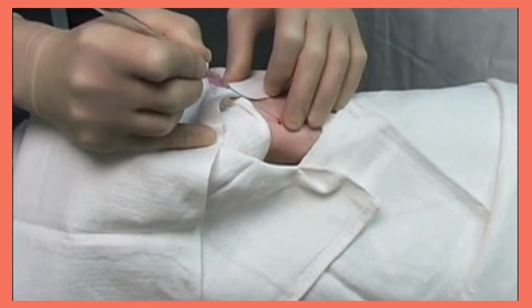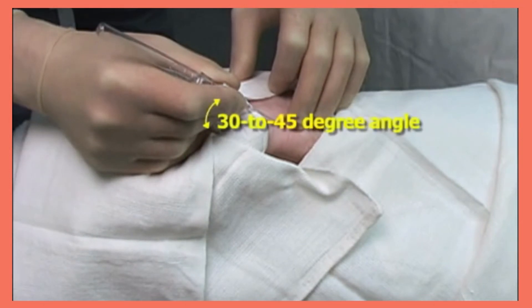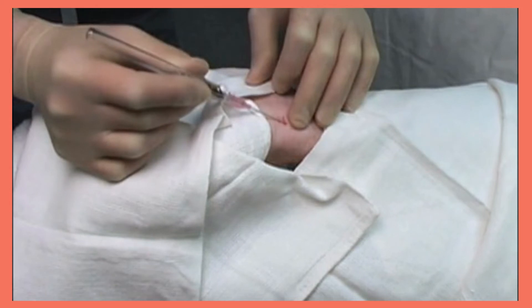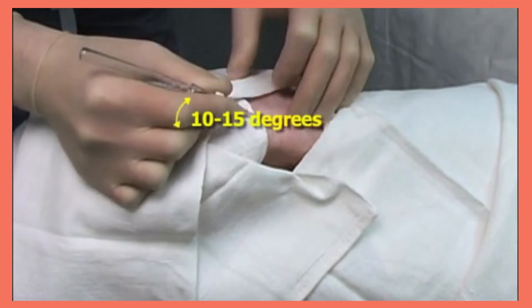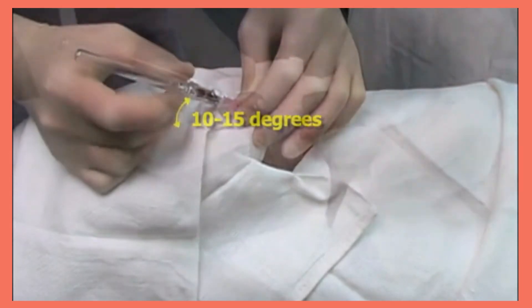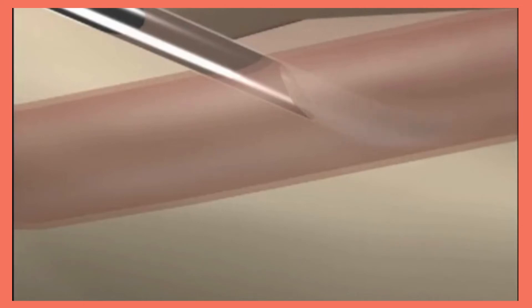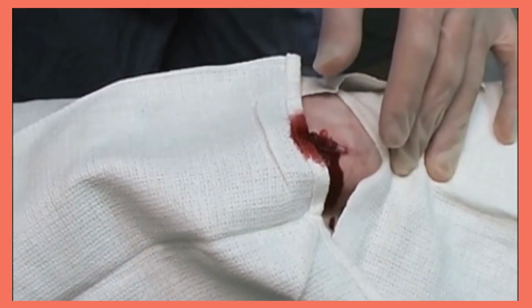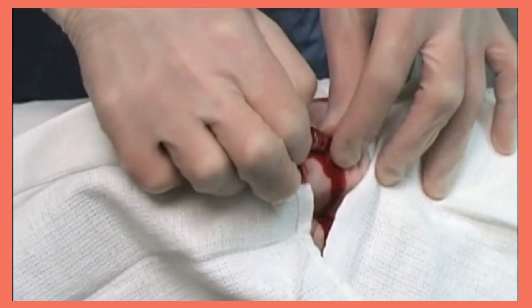In the over-the-needle technique, a catheter is advanced at a similar 30 to 45 degree angle. Once blood return is obtained, the needle is advanced slightly farther to assure that the catheter has entered the vessel. The needle angle is then lowered to 10 to 15 degrees and the catheter is advanced into the vessel. Proximal pressure is applied to the artery, the needle is removed, and the catheter is connected to the transducer system.